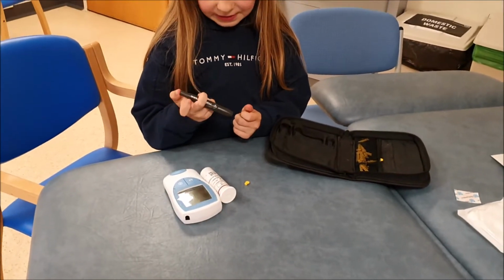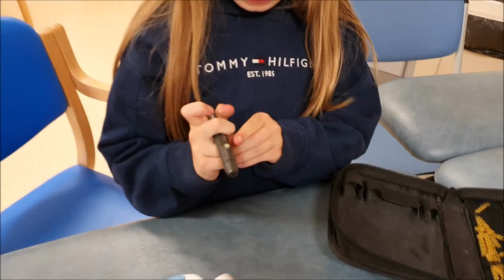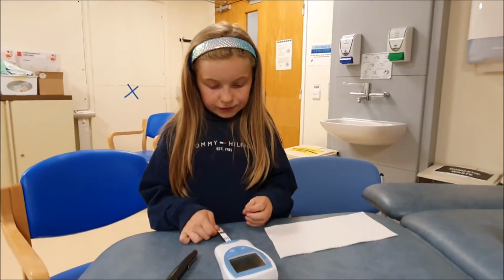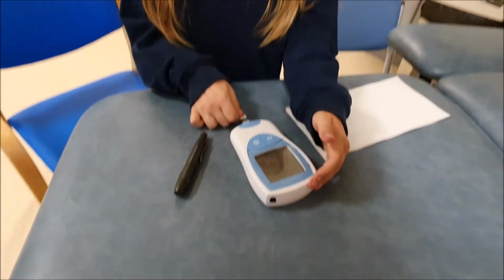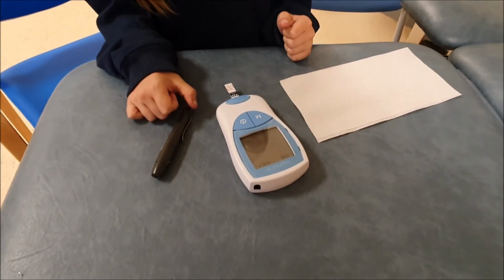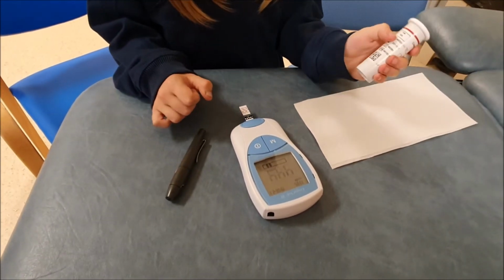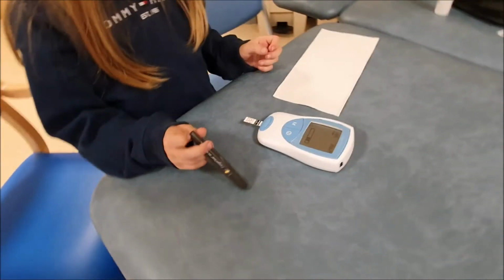And then press this, like the end bit. And then there will be that button that shines yellow and press that. So where the arrows are, you just put the strip in until it turns on. And then wait. And then on the monitor, the code should be right on the strip pot.